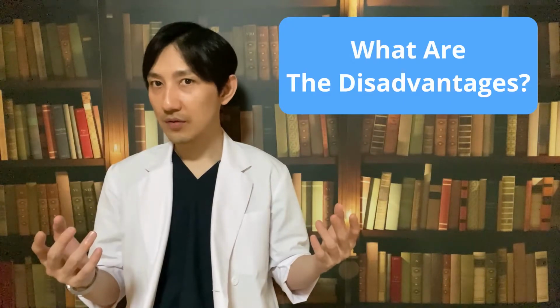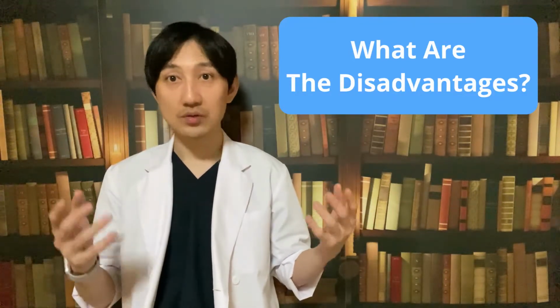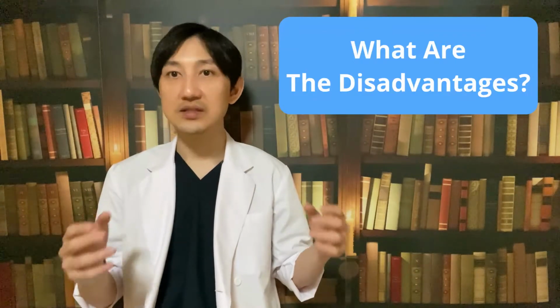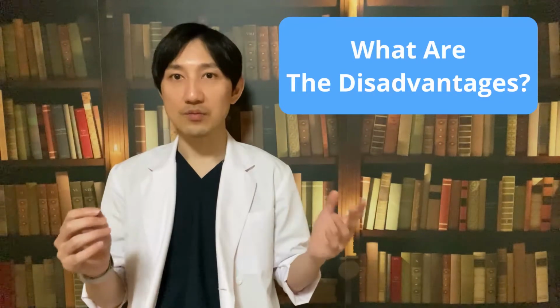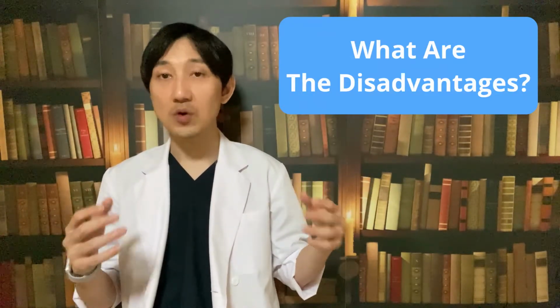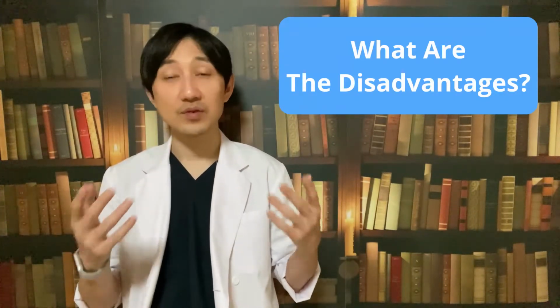One important disadvantage to consider is that it does not protect you against sexually transmitted infections or STIs. So depending on who your partners are, you may also need to use condoms. Also, there's a small possibility that you will get an infection during the 3 weeks after an IUD is fitted. Furthermore, it very occasionally happens that when the IUD is put inside you, it makes a hole in your uterus or cervix. This will heal by itself but be painful at the time, and you will have to have an operation to remove the IUD.